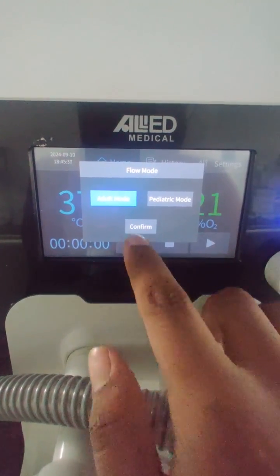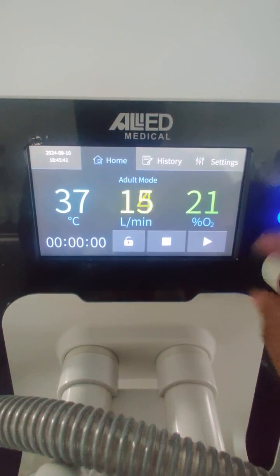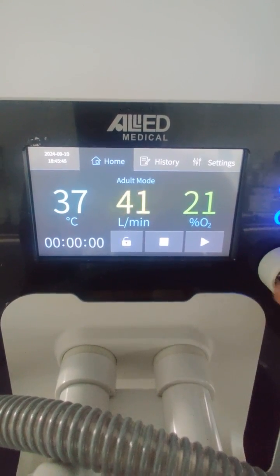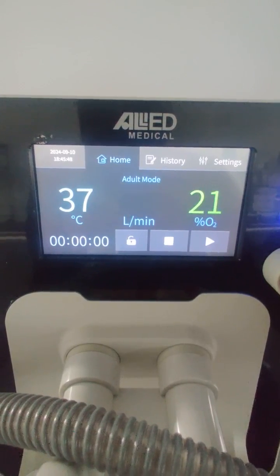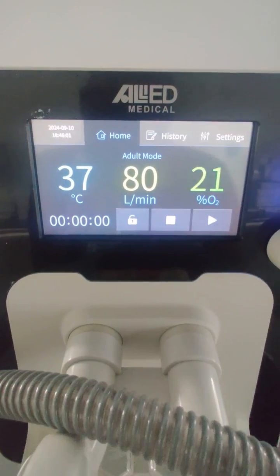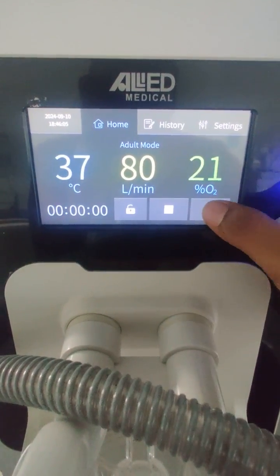After selecting adult mode and pressing confirm, in adult mode the flow starts from 10 liters per minute and goes up to a maximum of 80 liters per minute. You can also select the FiO2 from 21% to 100%.